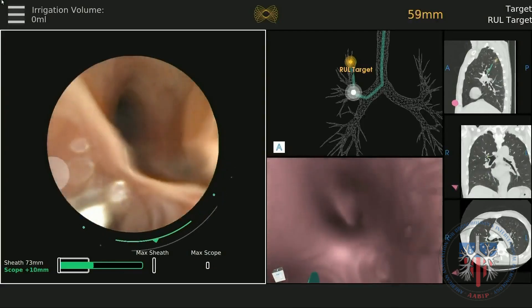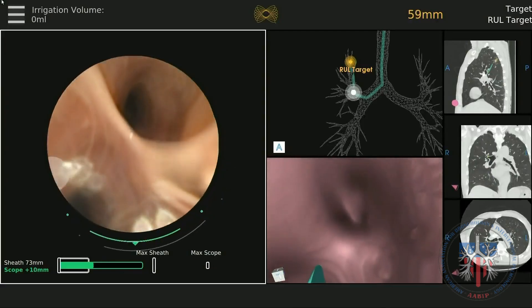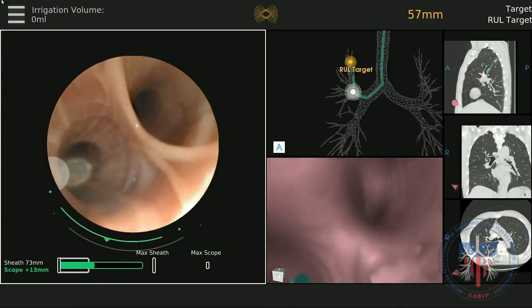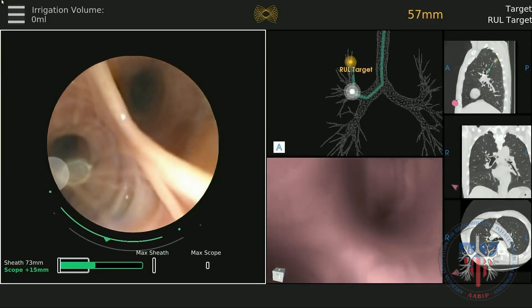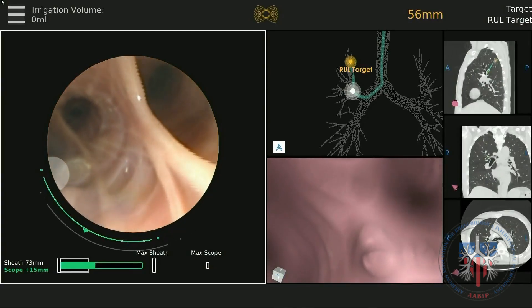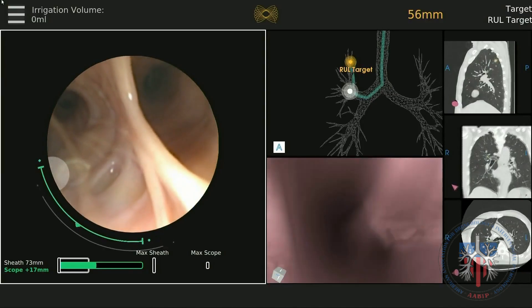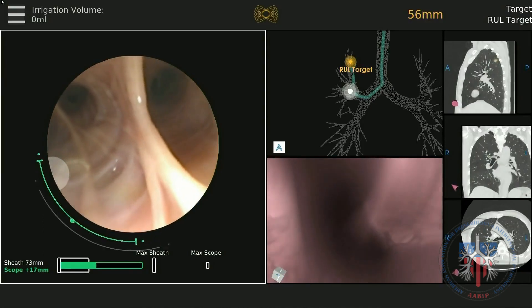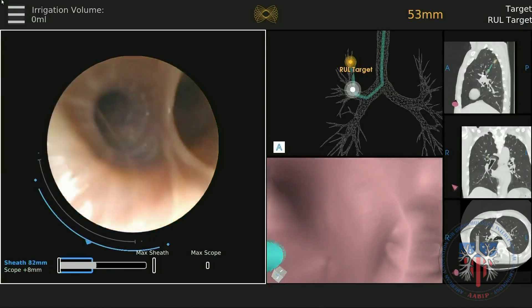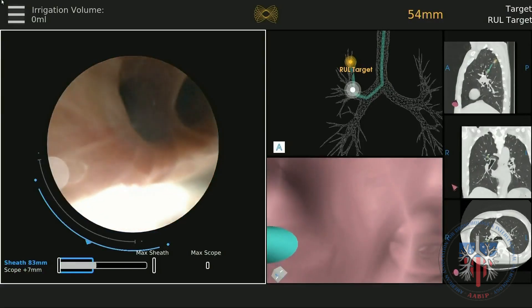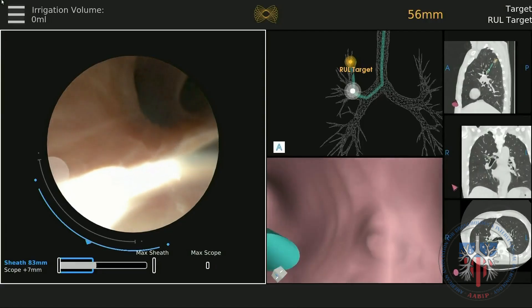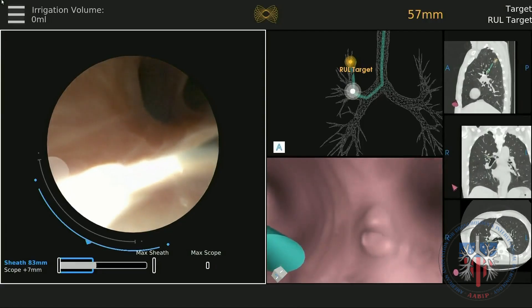You can see the angulation of the scope by the semicircular lines on the side. These will increase or decrease as your flexion changes. If maximal flexion is encountered and the airway remains difficult to access, one option is to use a modification of the Seldinger technique to access the correct airway.